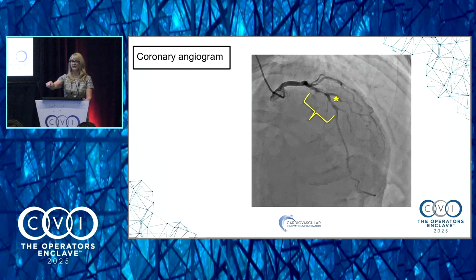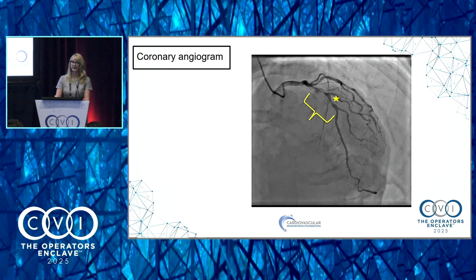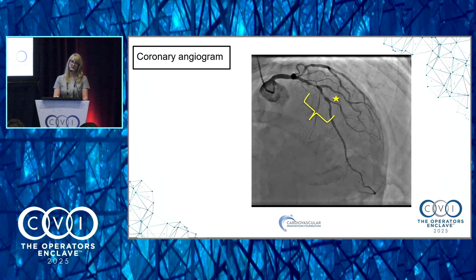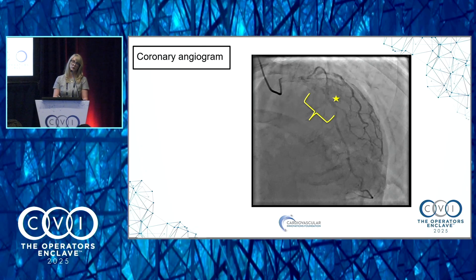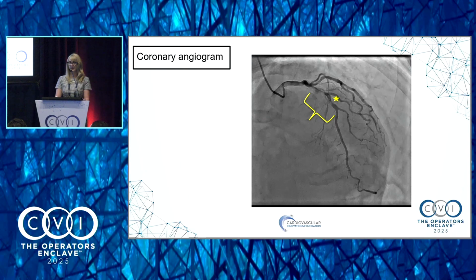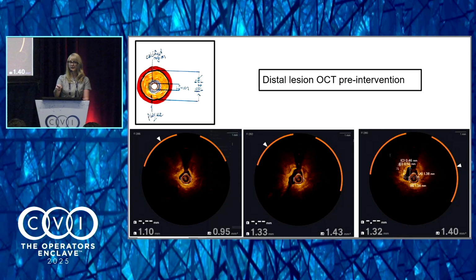Sorry, I'm going to go back there. This is her initial angiographic shot of her LAD, so you can see that there's two tight tandem lesions, especially that more distal lesion, probably 90% or greater narrowing in the mid-LAD, and the lesions do look even angiographically quite calcified. So initially I passed an OCT prior to the intervention.